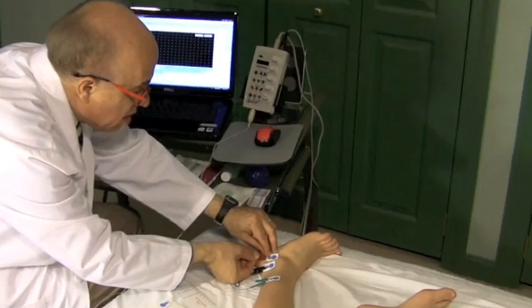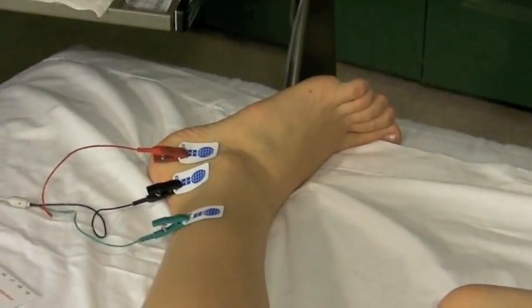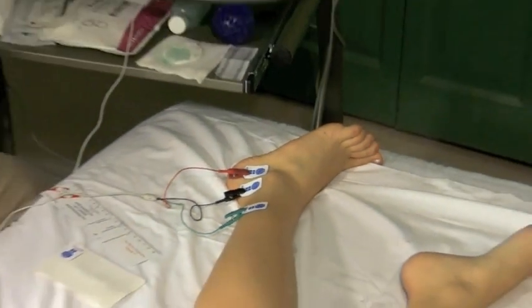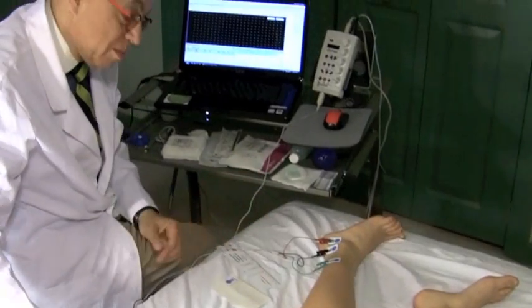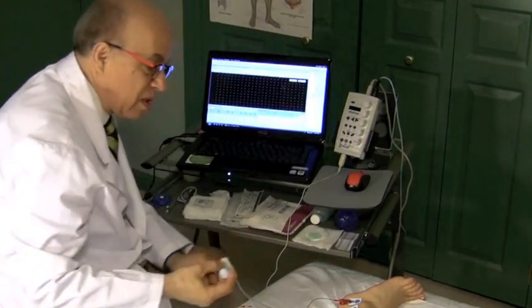One thing I find very useful in the lower extremity is to ask the subject if they feel the electricity going down their foot. If they feel it, that means you're stimulating the nerve. If they don't feel it, that means you're away from the nerve. I like to ask them this because that gives me good feedback.